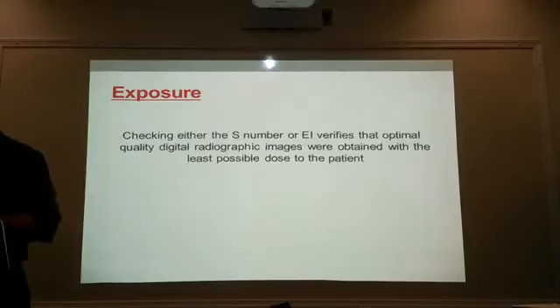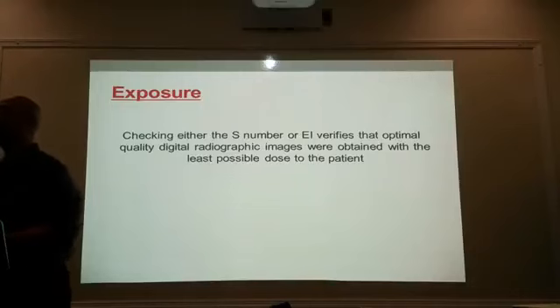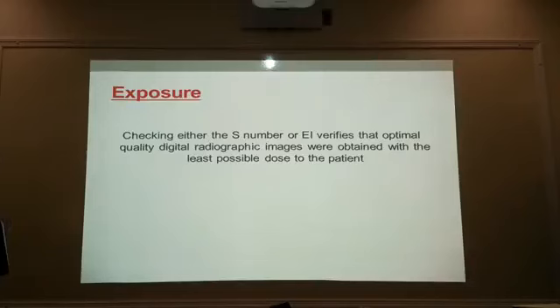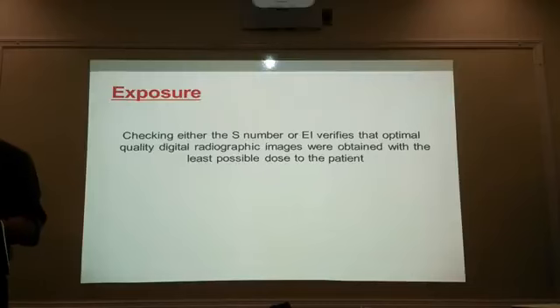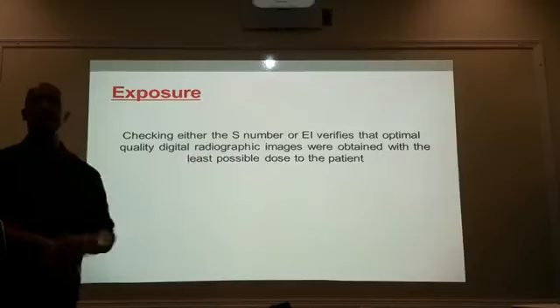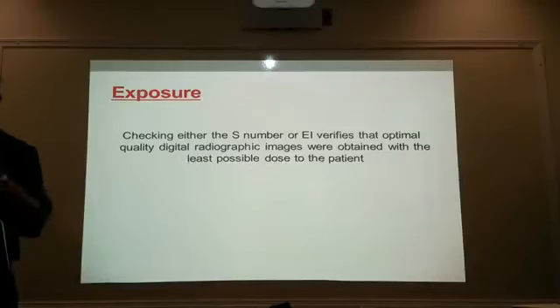So checking either the sensitivity number or the exposure index verifies that optimal quality digital radiograph images were obtained with the least possible dose to the patient. Because that is our objective, to get good images while maintaining and providing minimal radiation to our patients.